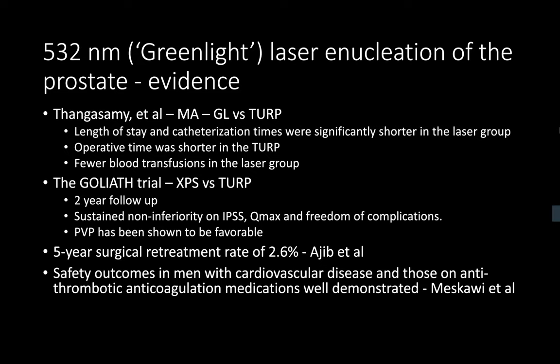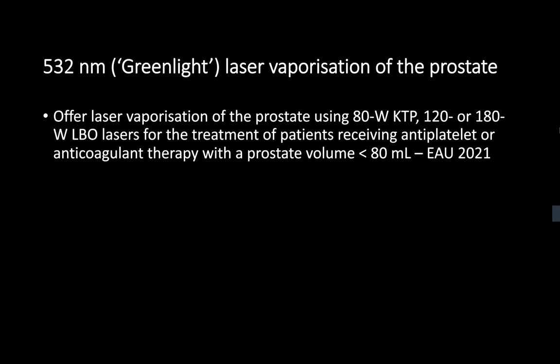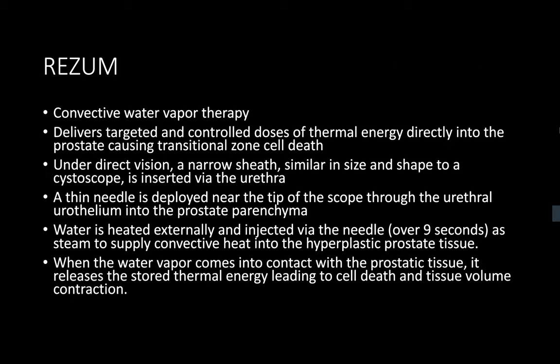Inside the system we have a retractable needle, and on the top of this needle there are 12 very small openings. They are arranged in 3 rows, each row containing 4 openings, and these 3 rows are at an angle of 120 degrees to each other. So what happens is that we inject this retractable needle into the prostate. The injection is delivered within 9 seconds, covering an area of 1.37 square centimeters within those 9 seconds, and it causes widespread ablation of the area.